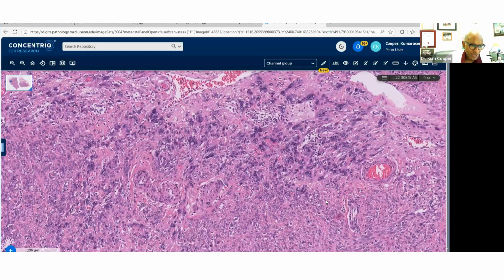I'm not too sure. You can ask my friend and ex-fellow Ahmed Lazim, who was very familiar with that. He's from Iraq and he's now at Memorial Sloan Kettering. But this is not leiomyosarcoma because it does not have that diffuse atypia, does not have mitosis, and does not have necrosis. So that's the thinking there.